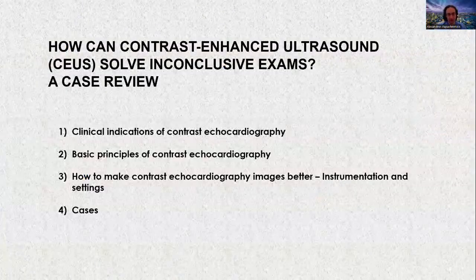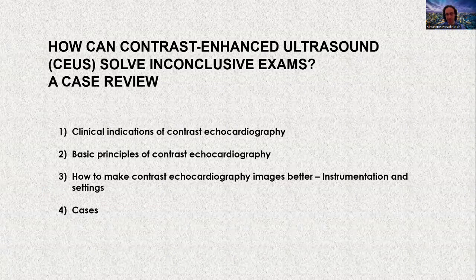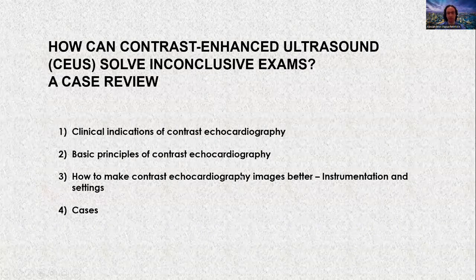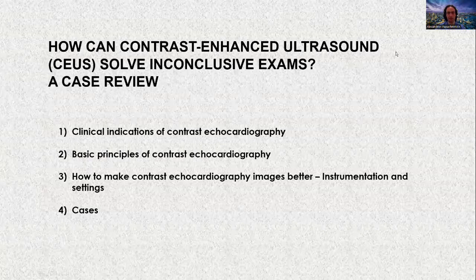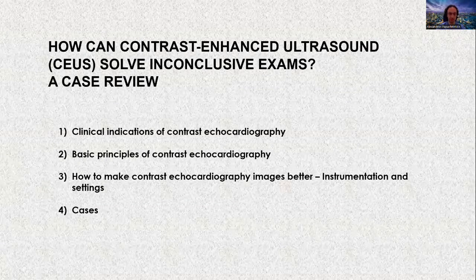So in my talk, I'm going to cover these topics. Number one, I'll talk to you very briefly about the clinical indications, which I believe the vast majority of the audience are familiar with. Second, I will describe the basic principles of contrast echo, which is physics. Third, we'll have a short discussion on how you can make contrast echo images better in terms of instrumentation and settings. And number four will be the majority of my talk. We'll discuss cases and review cases together.